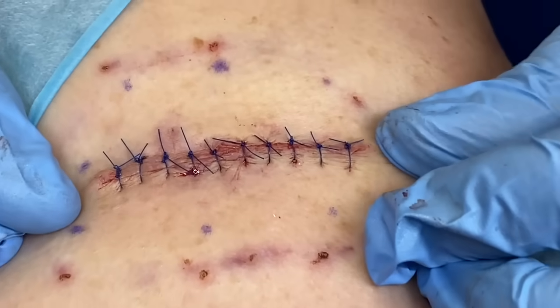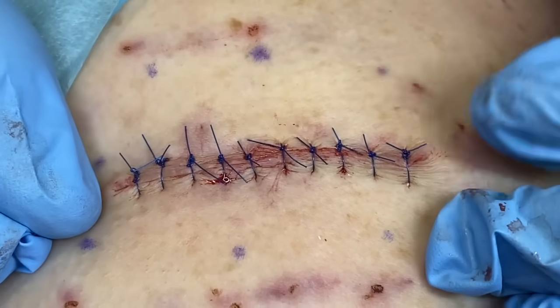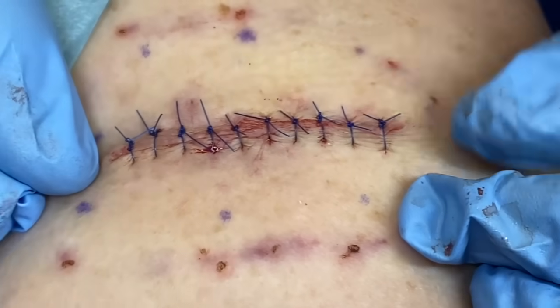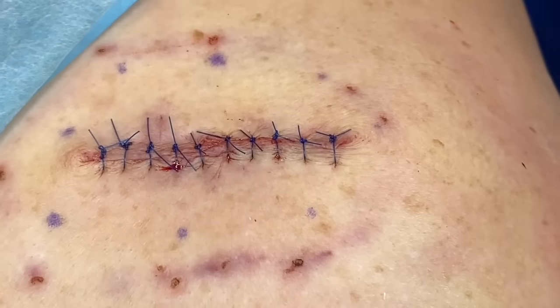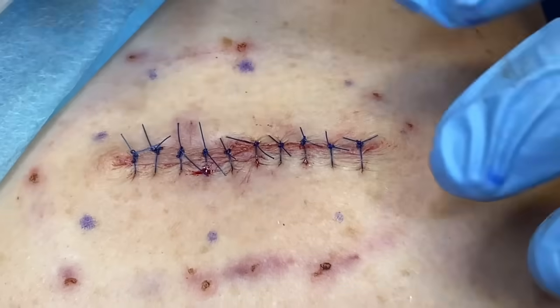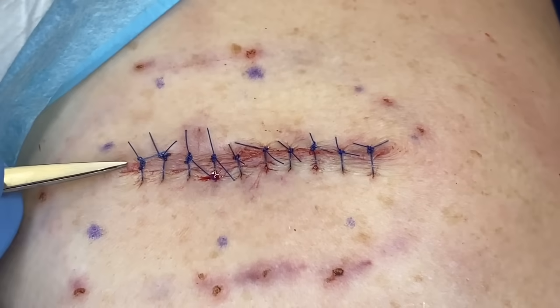So what do we think? Do we like the incision line? What about corners? This is always a problem. Was there any significant dog earring there? Maybe up there, just very minor amounts, right? So this will heal out perfectly for her. And that's more a function of our incision, so as long as that was done properly, that should fall nicely. That looks quite good. So we'll just see her back again in 10, 14 days.